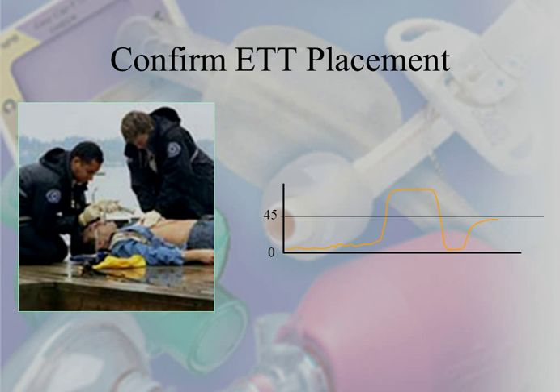Alright, so it says confirming the endotracheal tube placement. You can see the picture there on the right hand side. Basically, they've got hardly any end-tidal CO2. They give them a good breath, they start blowing off that CO2, they have that incomplete emptying, and then you get the big shot of end-tidal CO2 that blows off at the end.